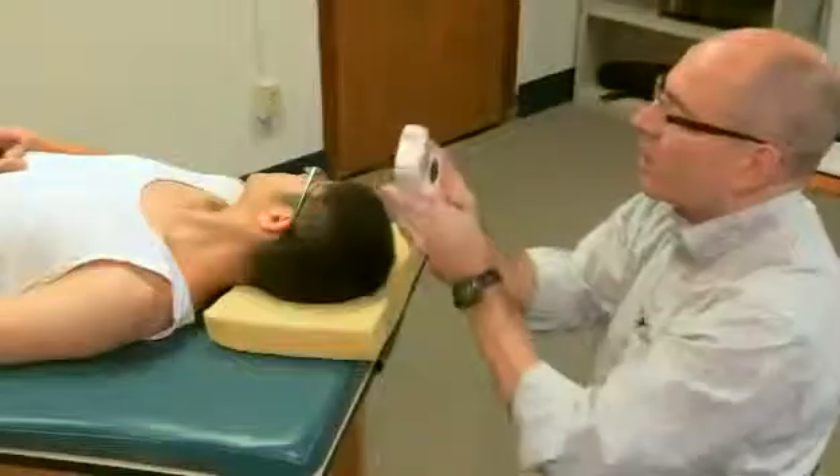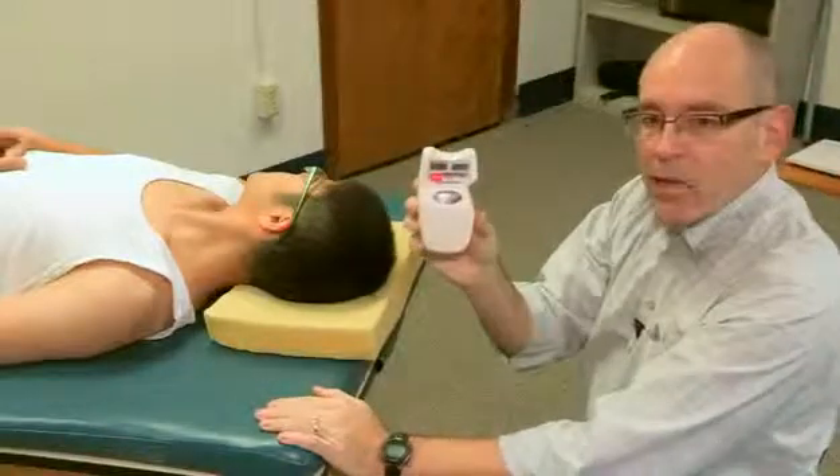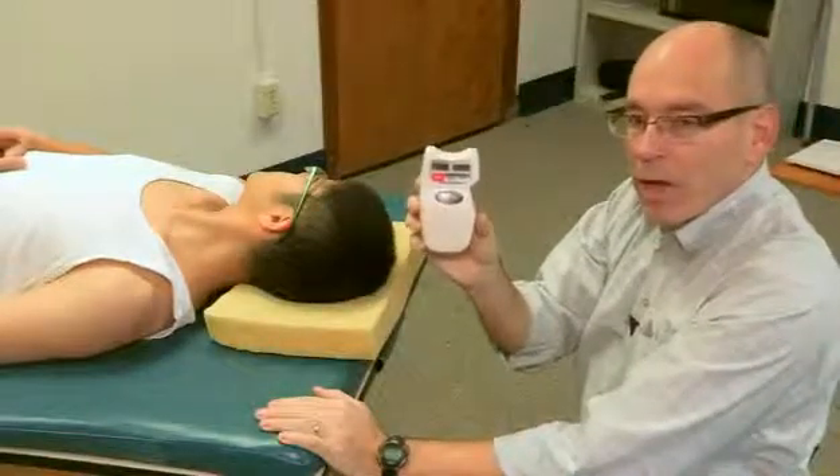Turn your head to the right as far as you can. I then reset the button, bring the inclinometer up, and reset it yet again. What it shows is that he had 60 degrees of neck rotation to the right.